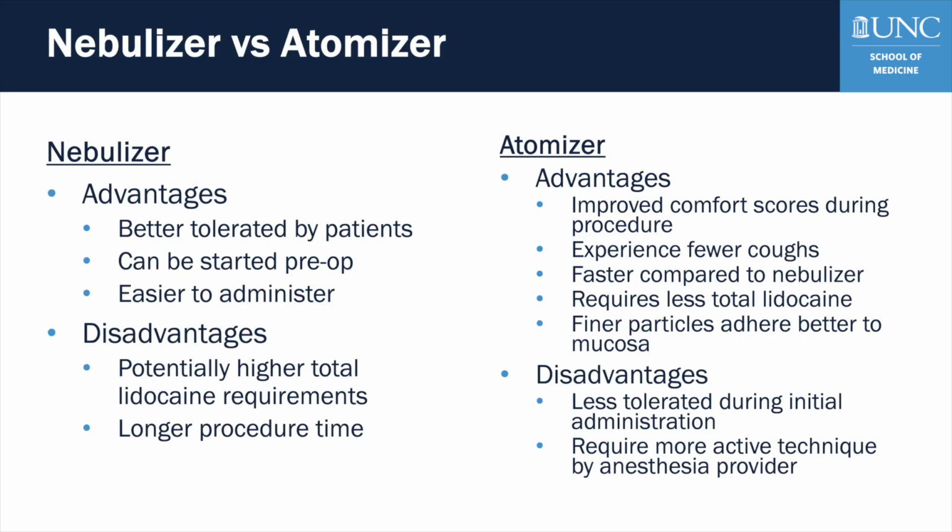Although some may prefer nebulizers over atomizers, as mentioned, our protocol favors an atomizer. Nebulizers are generally easier to administer, better tolerated, and can be started pre-op, but they often take longer and may require a higher total lidocaine dose. Atomizers, on the other hand, work faster, use less lidocaine, and provide better mucosal adherence with fewer coughs, leading to improved comfort during the procedure. Though they're less comfortable up front and require a more active technique from the provider, in practice, the choice depends on patient tolerance, time, and operator experience.